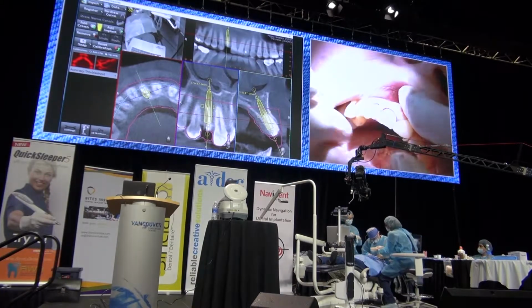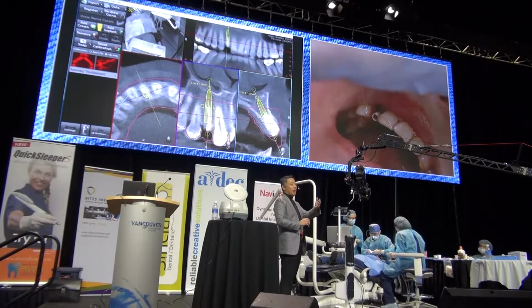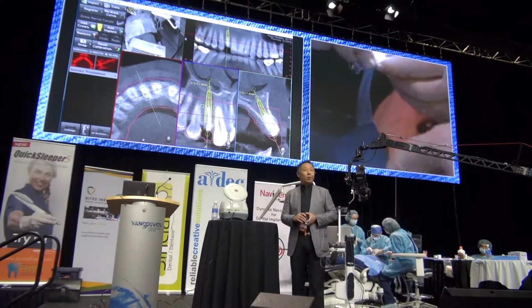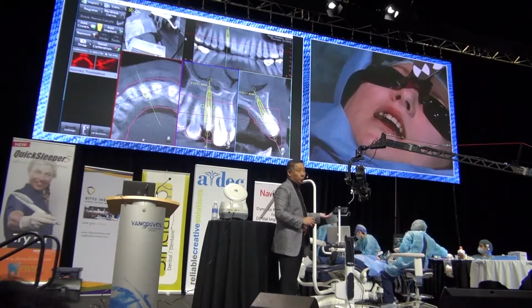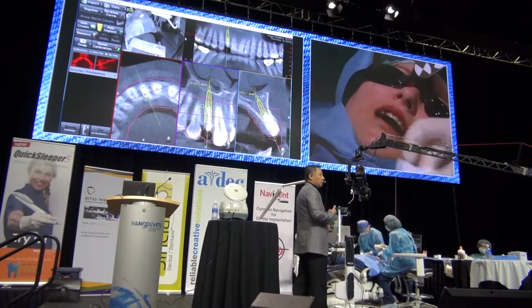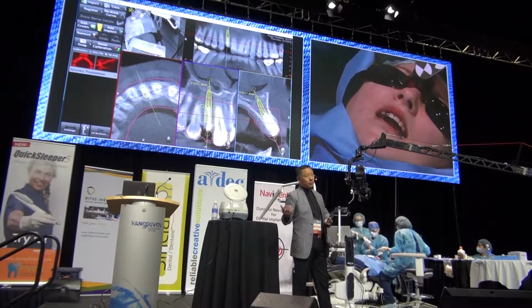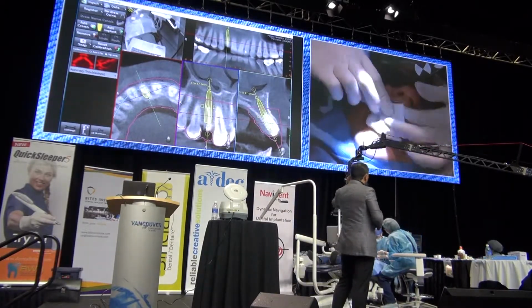There will be days and times when I can extract the patient's old crown, and my lab will modify that crown to have a lingual or palatal access. Sometimes I've used the patient's own tooth, pre-made by the lab. What else is better than the patient's old crown or tooth, because it had the natural emergence profile, angulation and position.